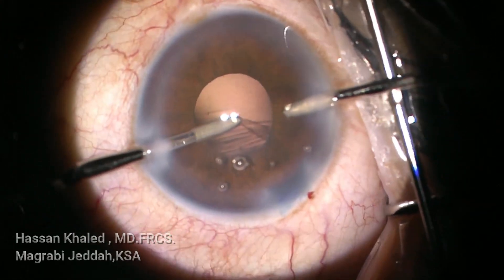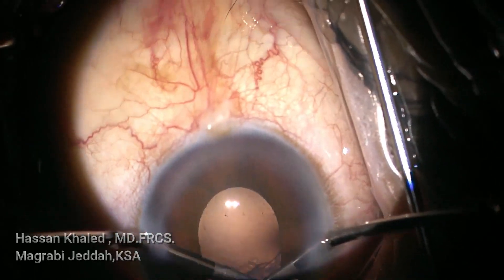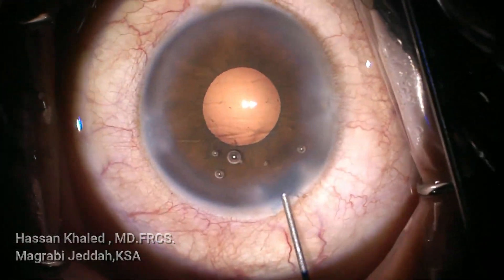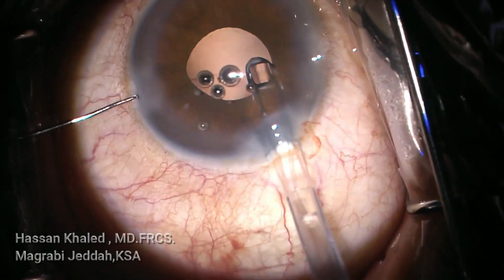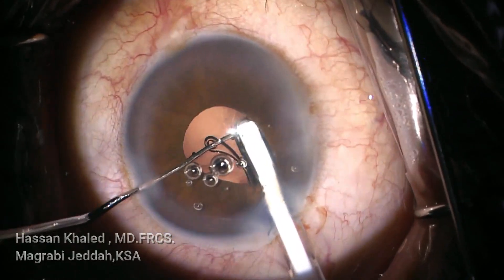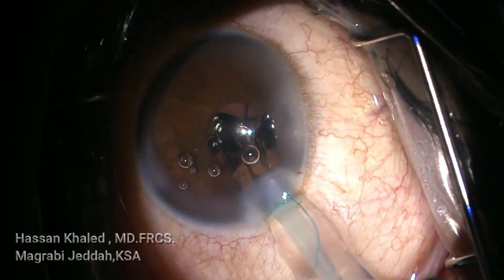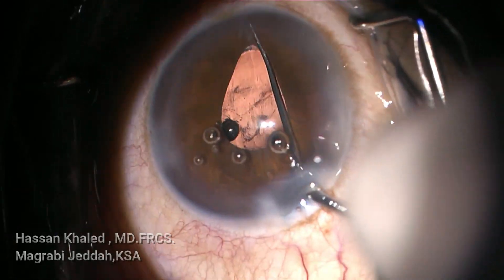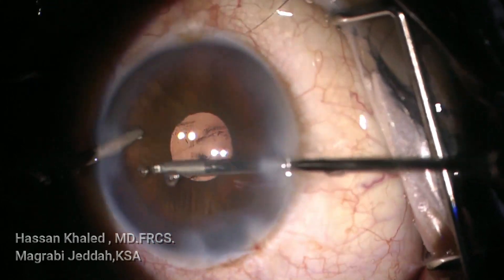In cases with a small pupil, we can use pupil expander devices like Malyugin rings, iris hooks, or other devices to assist. Now, as there is a weak zonule, I prefer to implant a capsular tension ring — this is a friendly zonular implantation technique. You can hold the eyelet of the CTR with a Sinskey hook and implant it gently. Then implanting a three-piece hydrophobic IOL in the capsular bag, followed by removing the OVD.